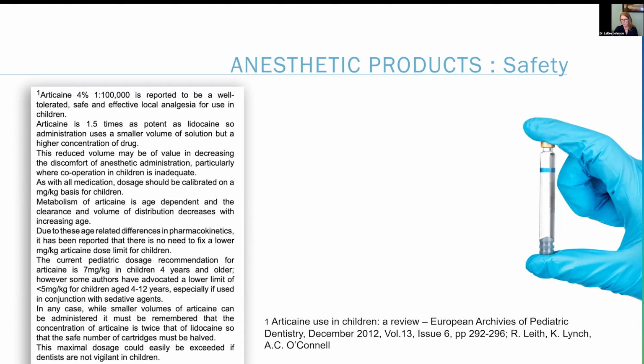Keep in mind, the manufacturer's recommendations are based on conventional measures of using this local anesthetic. I use articaine every single day on children under 4 years of age. And the difference is I'm not introducing it via block or infiltration. It's only IO, and it's very, very safe in that manner. And it also is more effective, faster acting, diffuses better, all of the things that we know.